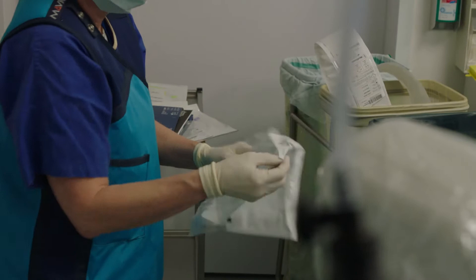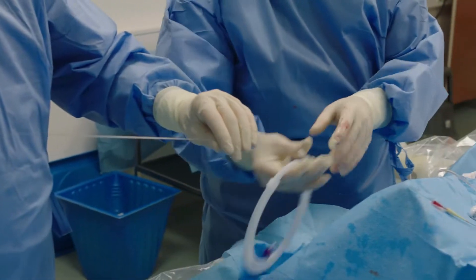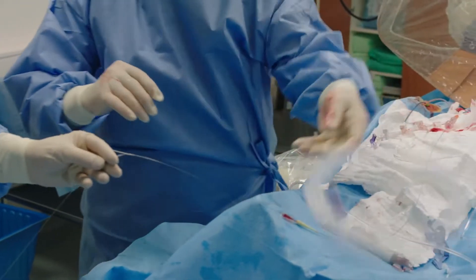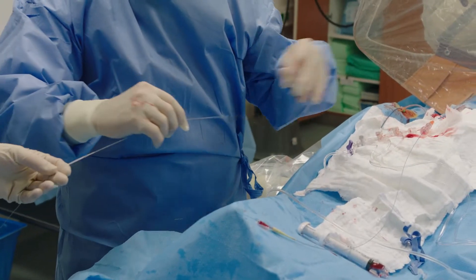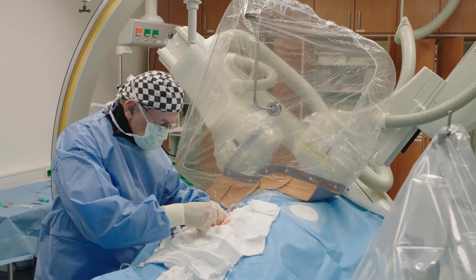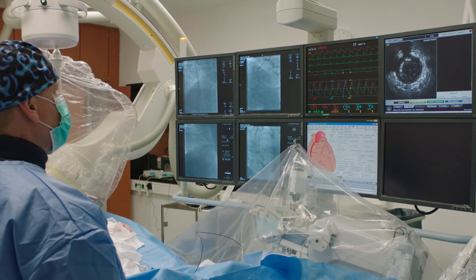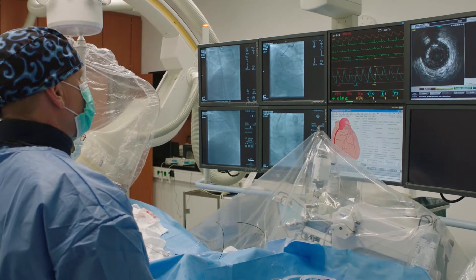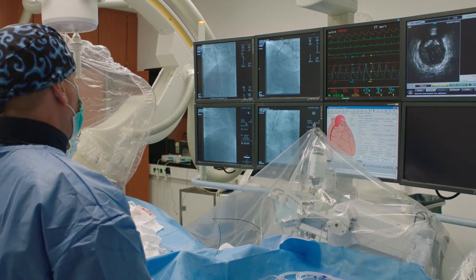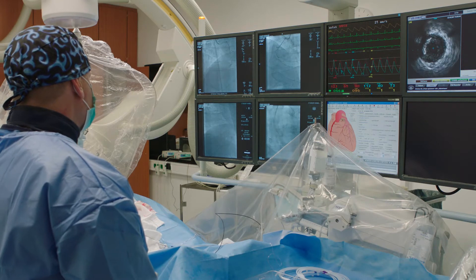Removing this microcatheter, I want to trap the wire, and then we put an IVUS on this catheter to analyze. It will be interesting to see the proximal size of the vessel, which looks so tiny for a regularly sized man. This is exactly a 3.5 mm — negative remodeling, no positive remodeling. And here is the artery, 4 mm, a lot of plaque.